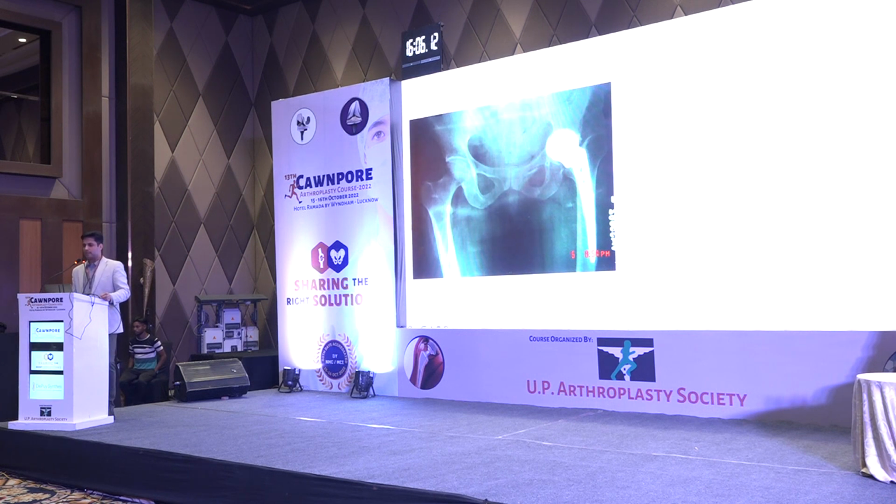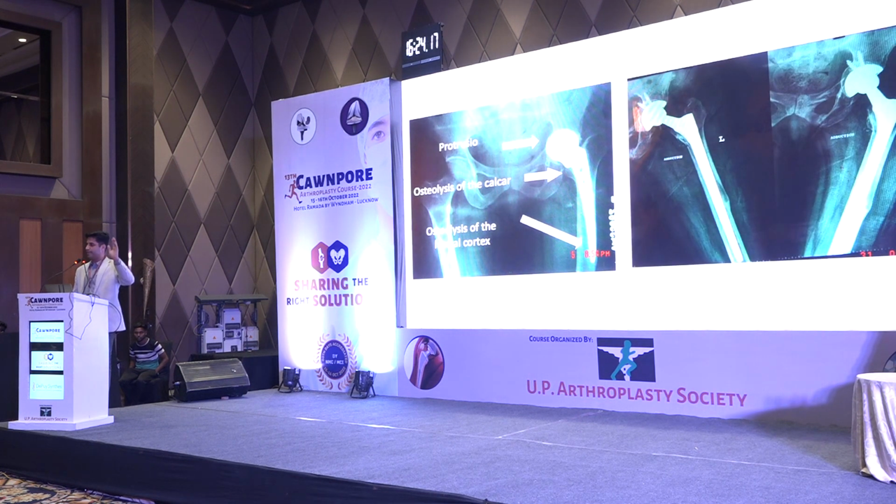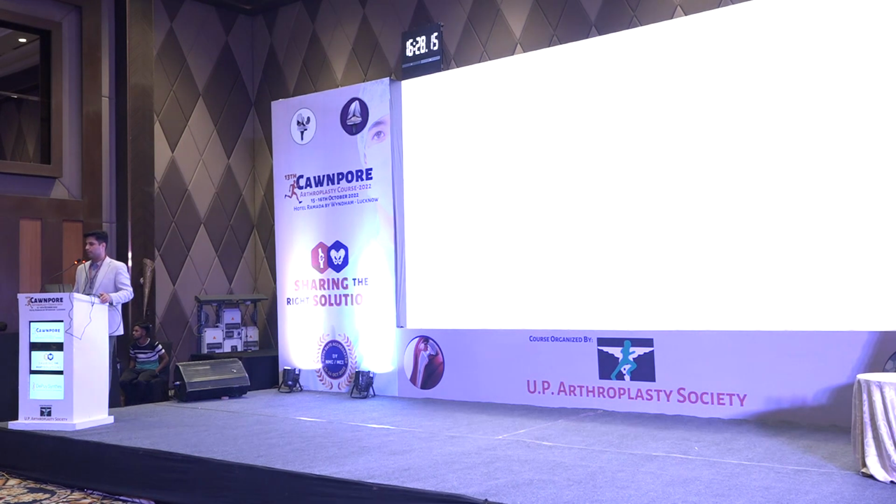Right. Now, there are some other cases like this where you have to be very careful when you go down into the stem, because if you just follow the natural curve or the course of the stem, you might actually cause perforations laterally. So be careful. There's protrusio, there's osteolysis of the calcar, and there's osteolysis of the lateral cortex. So be careful of these three things. So take each case on its merit. Do not have a cookbook approach for something like this.